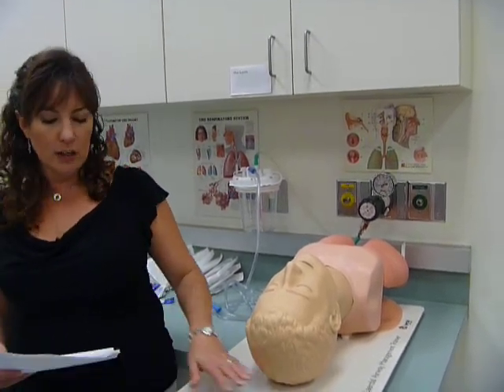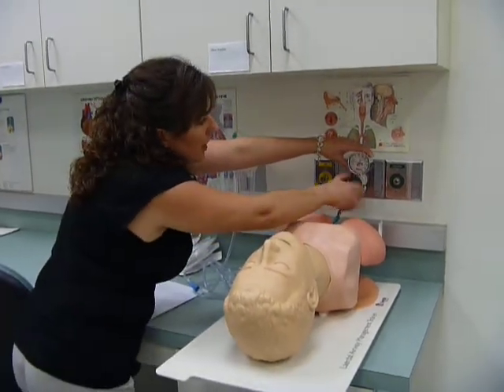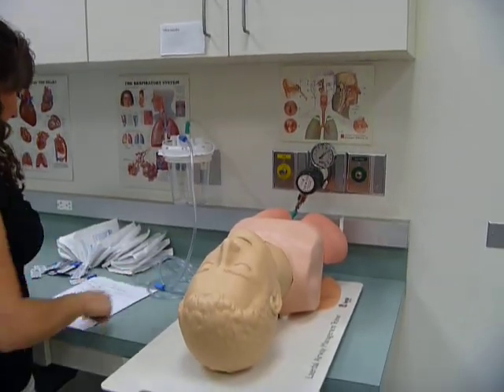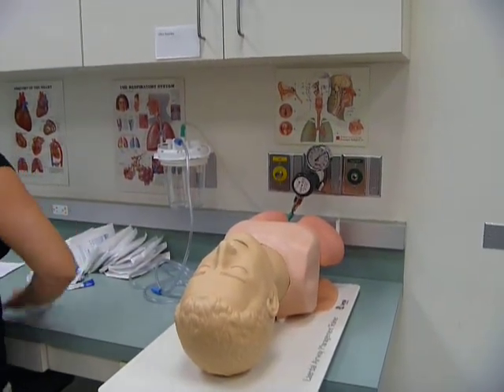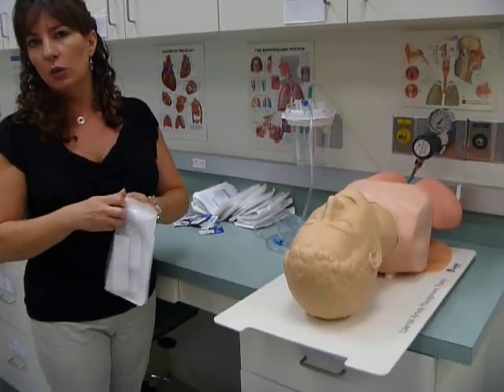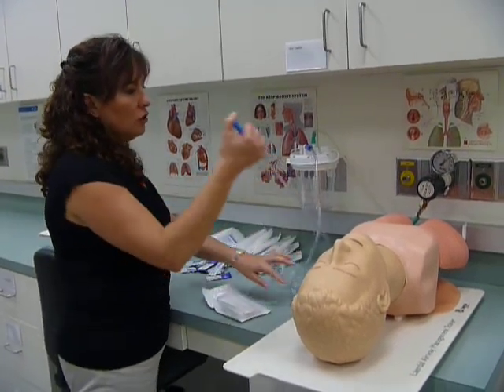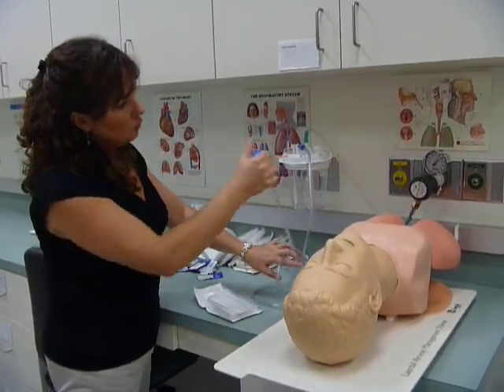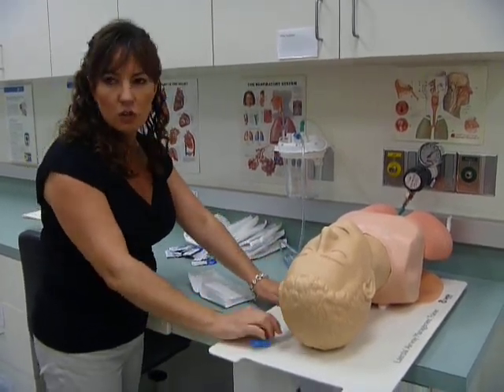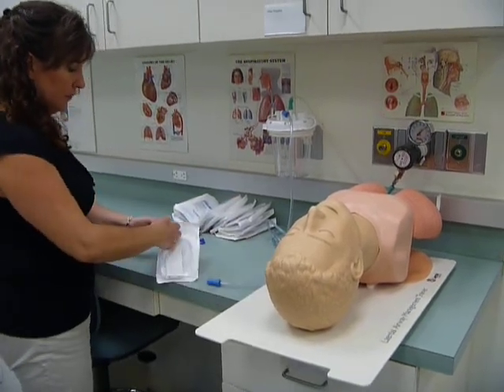So first, I'm going to have you suction the patient. You're going to turn your suction manometer on 120, okay? I'm going to first show you how to suction, and then we're going to talk about the suction catheter. So one, you want to make sure it's on 120 and you have suction. So have this laid out first, because once you get your sterile gloves on, you can't touch anything else. So I have it all ready.